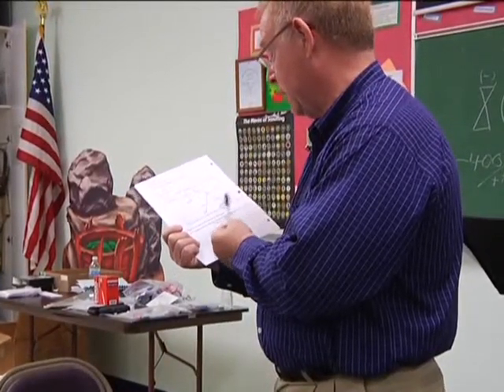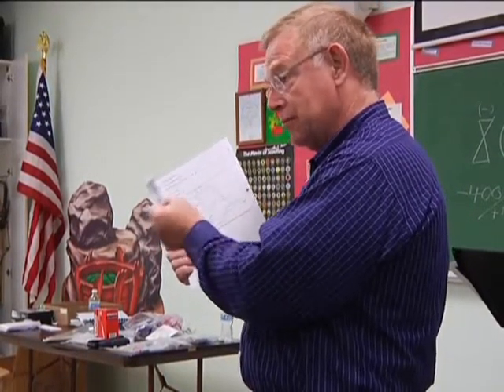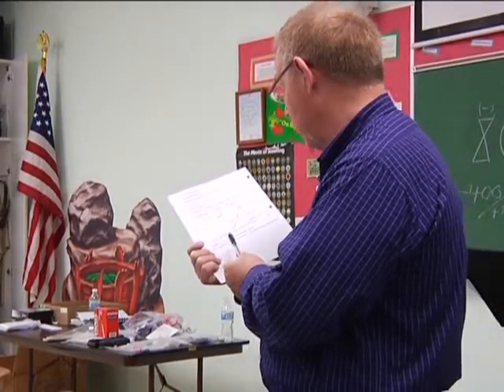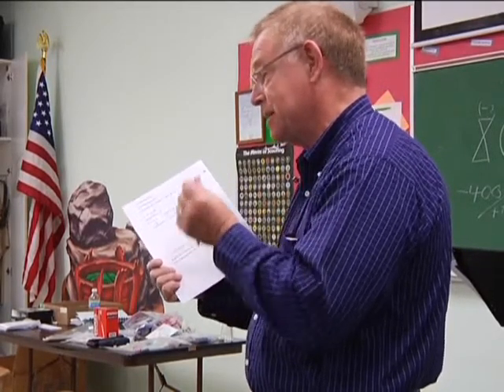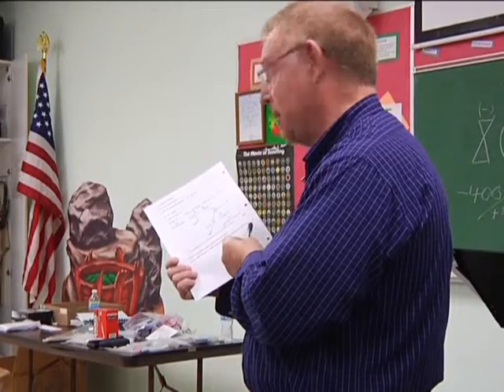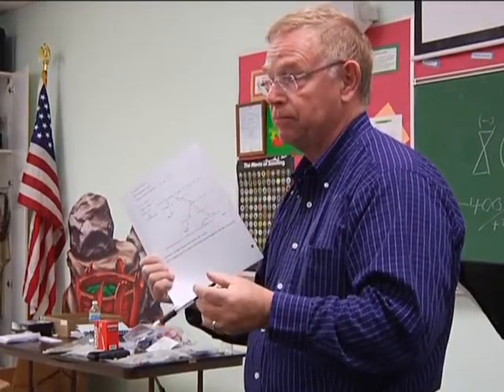Okay? If he chooses plus 1.25, then you follow exactly the same process with plus. Go up in plus until he chooses the weaker of the two. If the complaint is poor near vision, follow exactly the same process with plus lens, with the exception of cataracts. Just skip the screening step. Go up in plus until the patient chooses the weaker of the two choices, and that's what you prescribe.